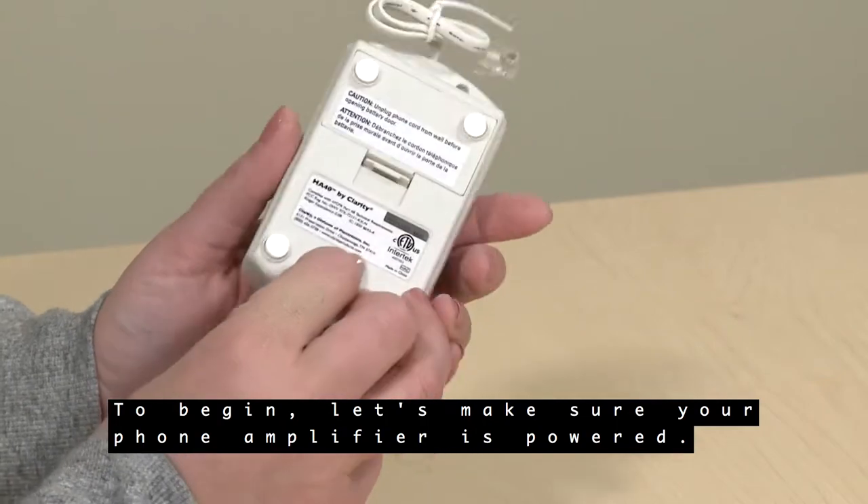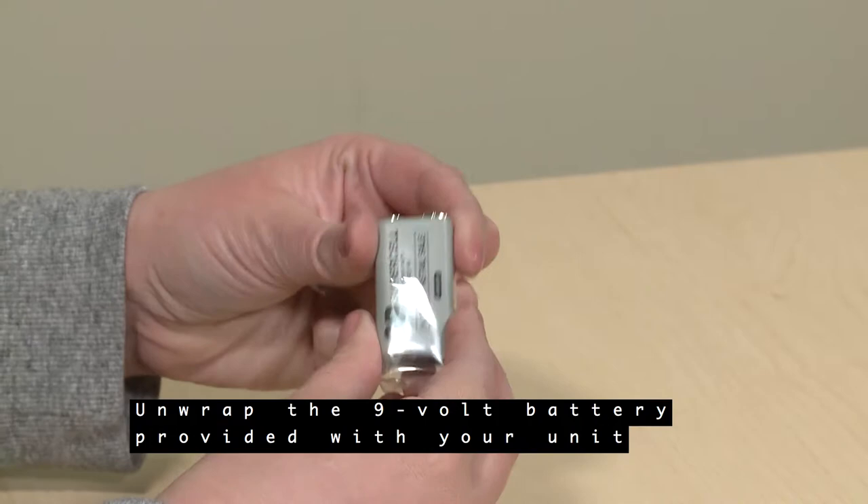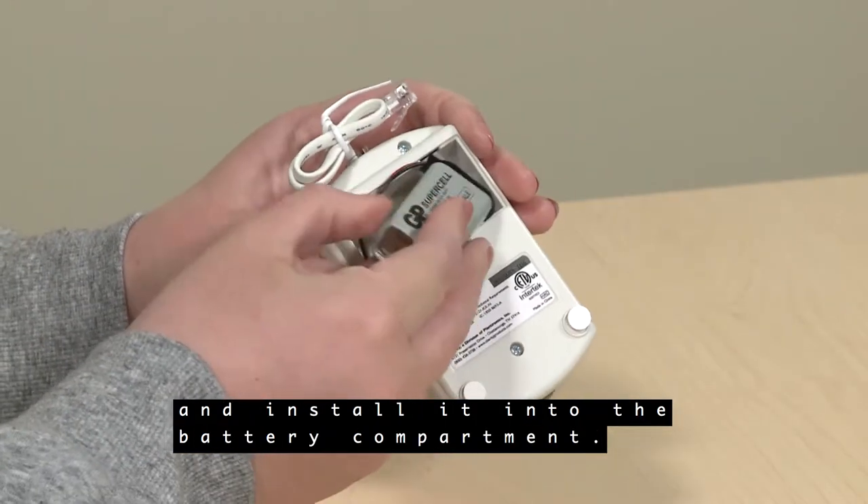To begin, let's make sure your phone amplifier is powered. Unwrap the 9-volt battery provided with your unit and install it into the battery compartment.